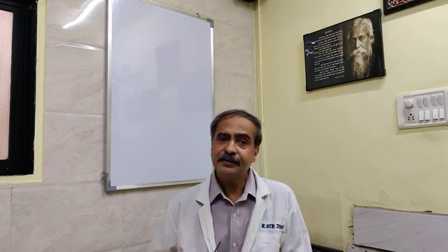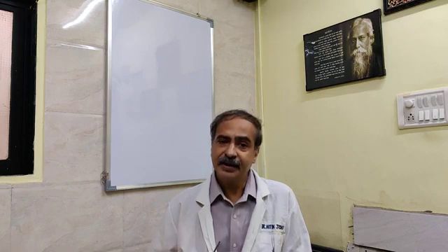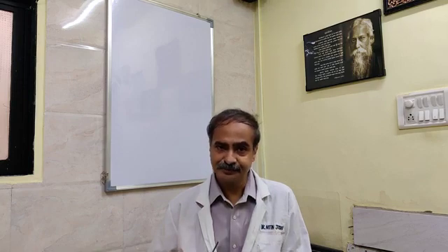In case of the sexually active young male with small prostate but significant lateral lobes, bladder neck incision is the procedure of choice. In case of bladder neck incision, the incidence of retrograde ejaculation is significantly lesser as compared to TURP. According to Orandi, one bladder neck incision at 6 o'clock position may not be sufficient, and so he advocates 2 incisions at 5 o'clock and 7 o'clock position.